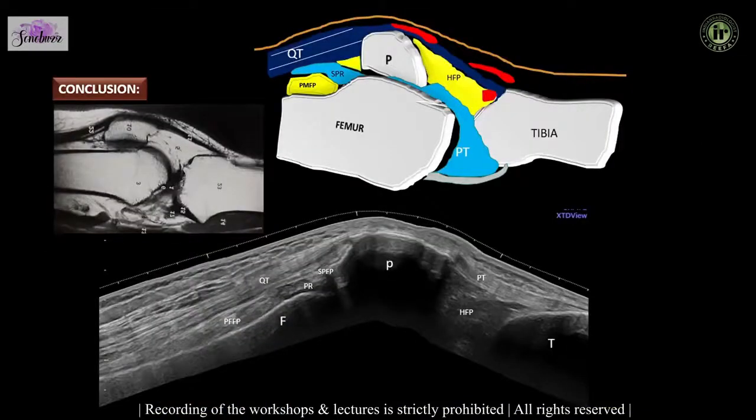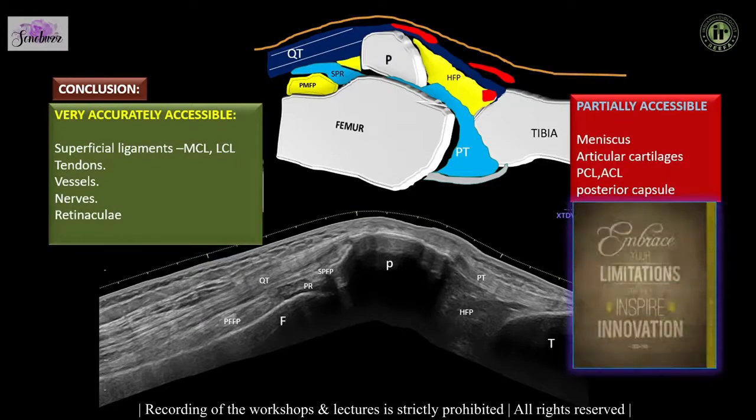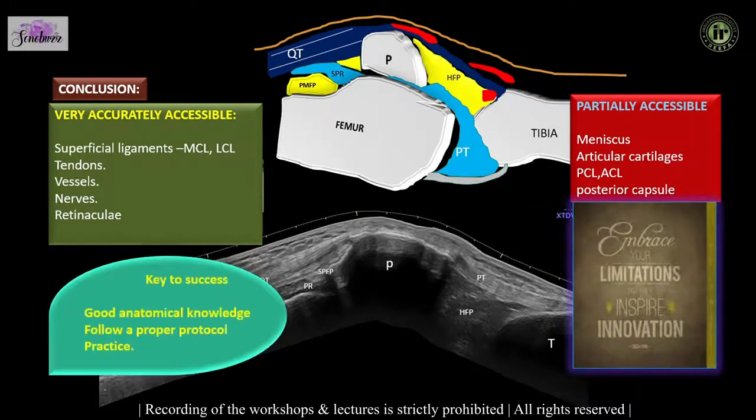So that concludes our knee examination, and in conclusion, I would like to say that every diagnostic tool has some advantages and some limitations, and we should know our limitations because limitation inspires innovation, and there is always a key to success, and in MSK ultrasound, good anatomical knowledge, a proper protocol and practice give us that key to success.